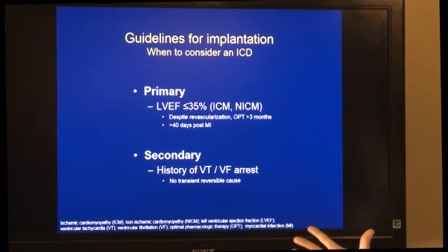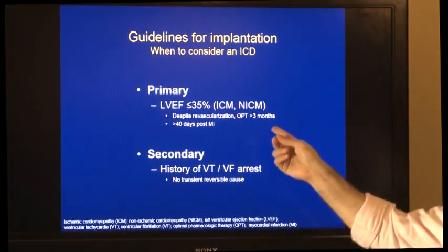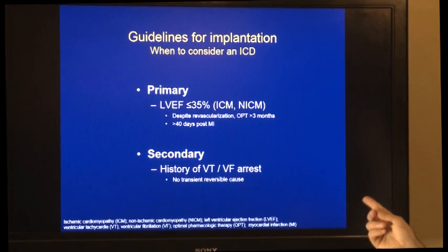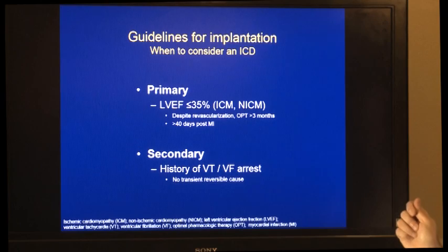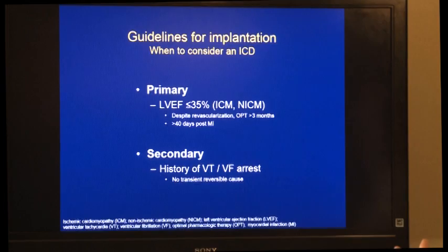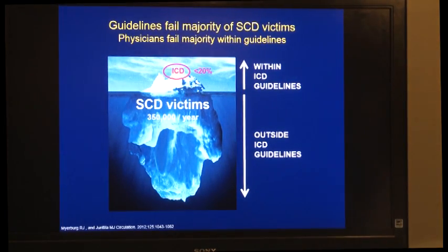You've never had an arrhythmia, but you're at high risk, so we give you defibrillator protection. So while you're waiting to meet these waiting periods and fulfill that criteria, how do you protect someone from the ongoing risk during those periods? And we'll see that the Wearable Cardioverter Defibrillator provides opportunity to give protection during those waiting periods. And then also a secondary prophylaxis. So you've had a malignant ventricular arrhythmia. There is no obvious reversible cause to that arrhythmia, so you deserve defibrillator protection, and we can implant defibrillators without a particular waiting period. So kind of those two broad categories.